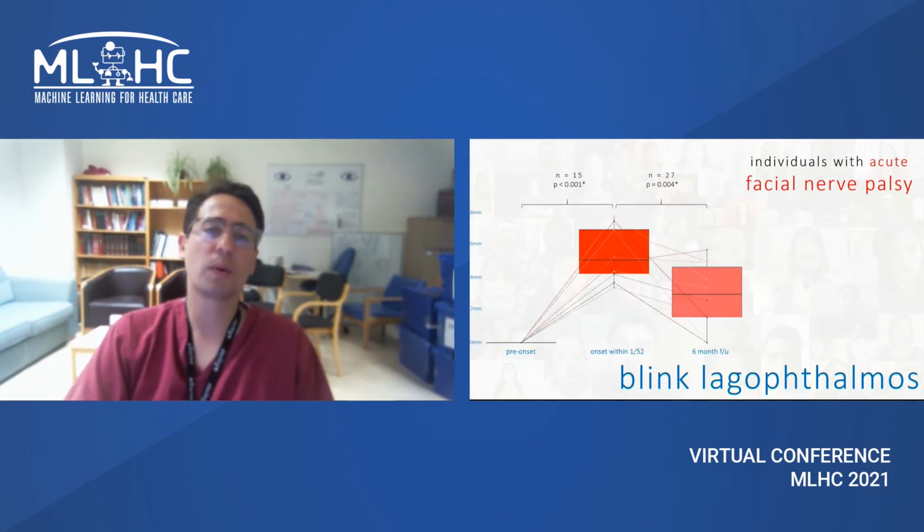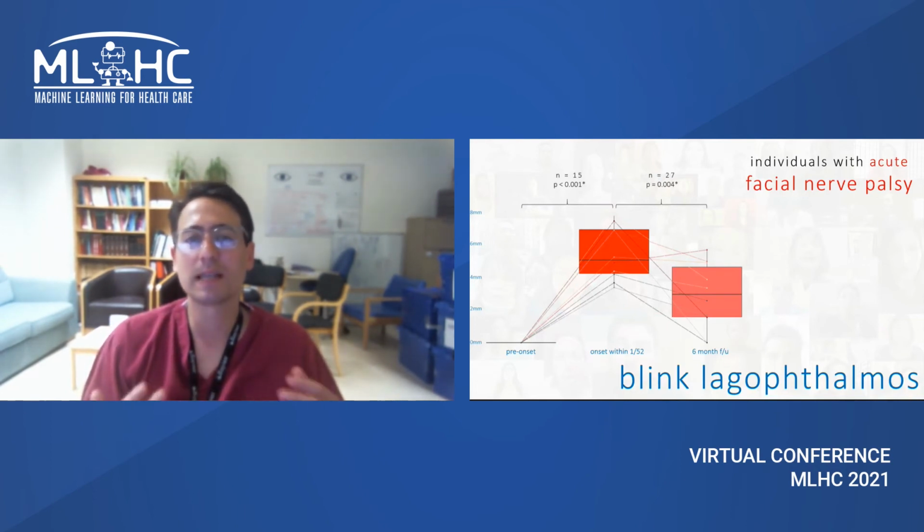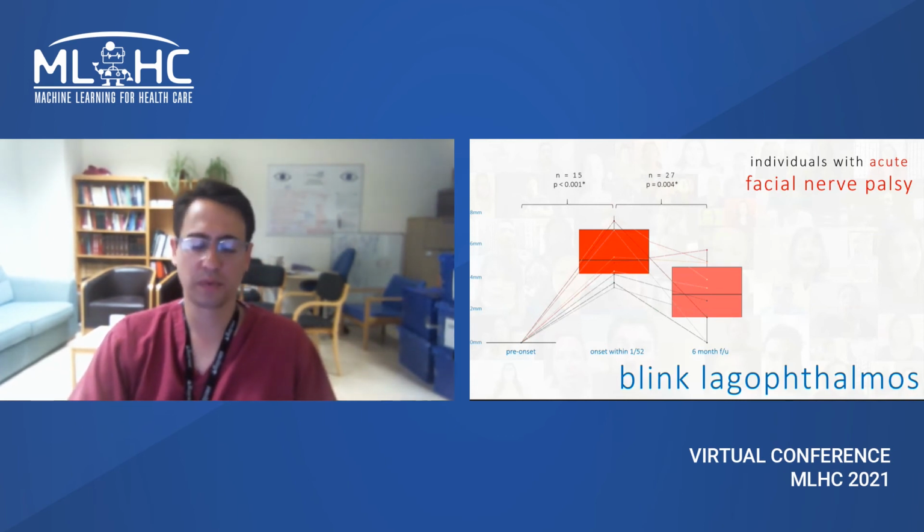So moving on from those population level comparisons, we can also start to appreciate the natural course of the disease if we look at multiple time points in the same individual. So for instance, Bell's palsy tends to come on dramatically compared with baseline. And while it often slowly recovers, it can often leave some subtle residual impairment that has always been difficult to quantify. And with this system, we can start to appreciate those differences in recovery.